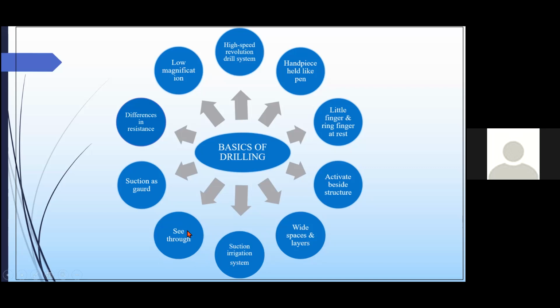A very important training is to see through the structures. Whenever we are drilling, we must train our eyes to see through the last remaining shell of bone before the actual exposure. It can help us to avoid damage to underlying delicate structures. We should also train our eyes to see any subtle change in the color or structure of the bone. Also, we should notice the difference in resistance or the sound heard when we are drilling. As we know, with different bony structures or a vessel like the sigmoid plate, the sound changes. So one should be very vigilant about these drilling techniques.